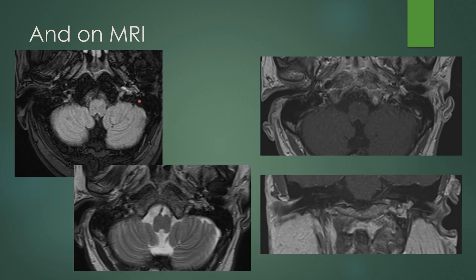On MRI, you see abnormal hyperintense FLAIR signal in the area of the middle ear and mastoid at the level of the jugular bulb on the left side. On the T2-weighted image it looks like a permeative process of bright signal, and when you give contrast the mass enhances. Here's the middle ear component extending down to the jugular bulb, shown on coronal compared to the normal side where you see no enhancement.